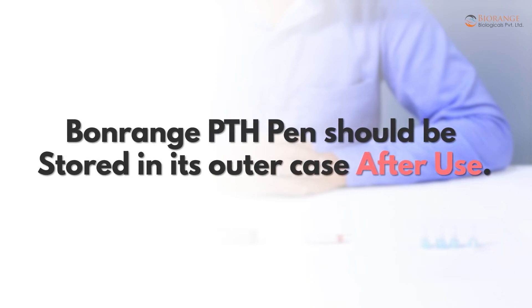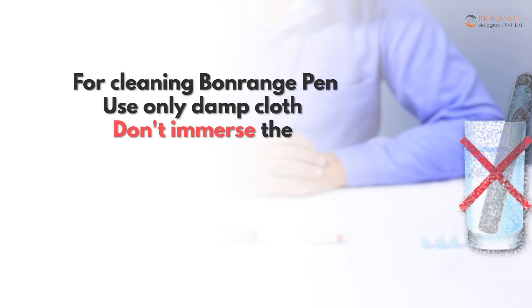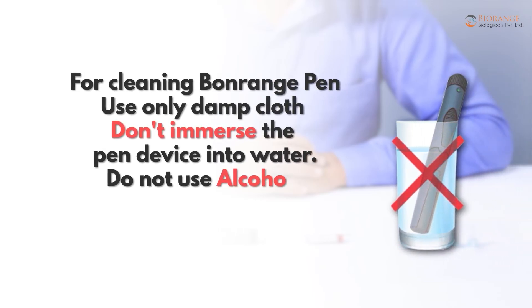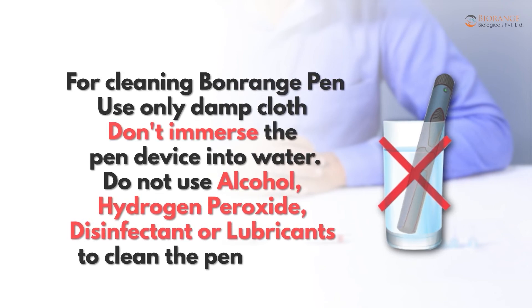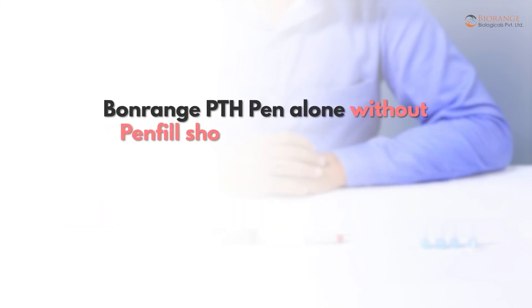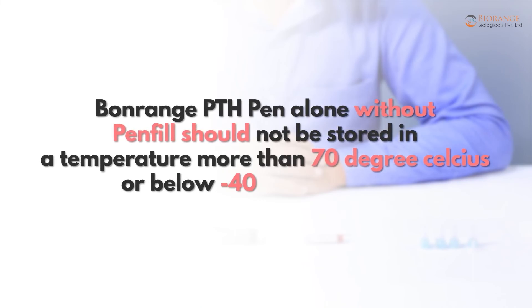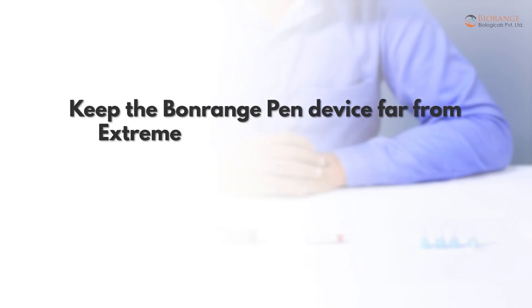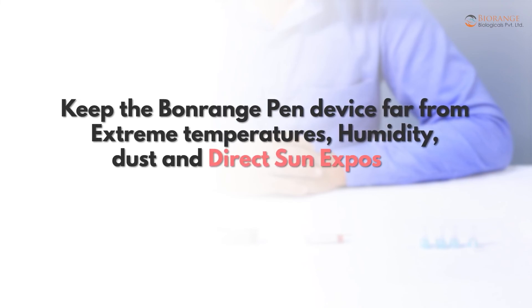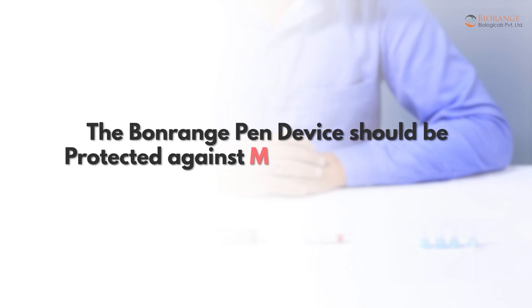For cleaning Bonrange Pen, use only a damp cloth. Do not immerse the pen device in water. Do not use alcohol, hydrogen peroxide, disinfectant, or lubricants to clean the pen injector. Bonrange PTH pen alone without pen fill should not be stored at a temperature more than 70 degrees Celsius or below minus 40 degrees Celsius. Keep the Bonrange Pen device far from extreme temperatures, humidity, dust, and direct sun exposure. The Bonrange Pen device should be protected against major physical forces.